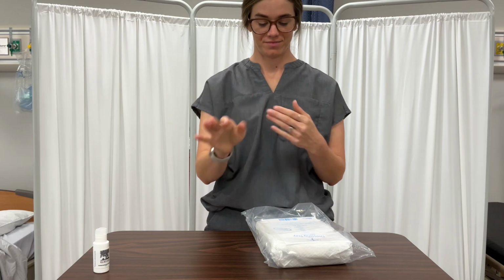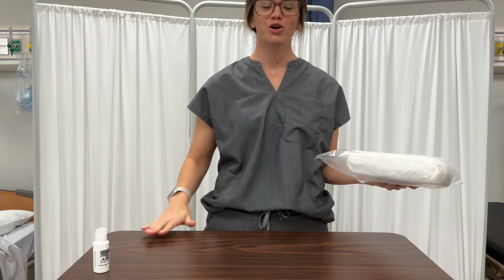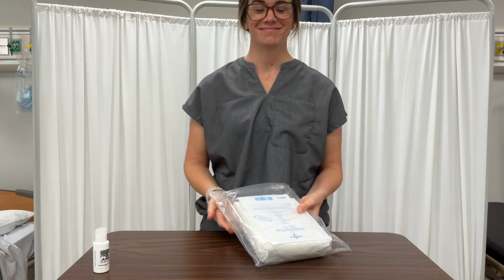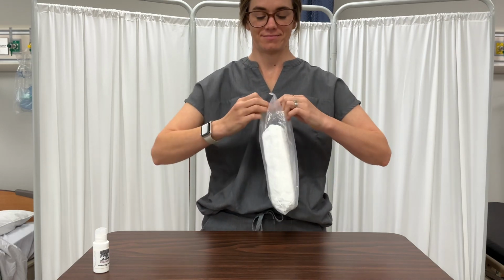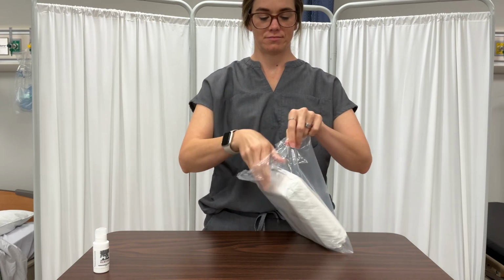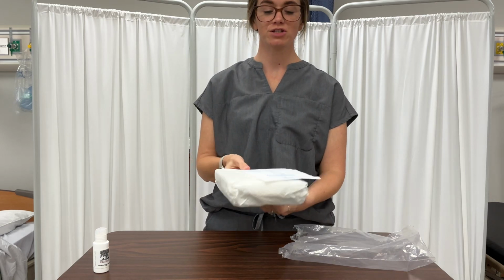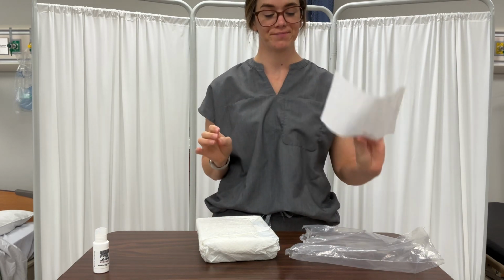And she's going to select a clean, dry, flat work surface above waist level. Your bedside tables are not clean until you clean them. She's going to open the outside cover and remove the package and place it on her work surface. If you don't know what items are in your sterile packing, usually it comes with a list, so make sure you check that out.